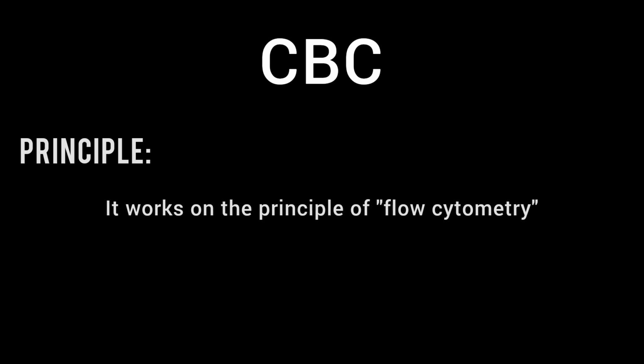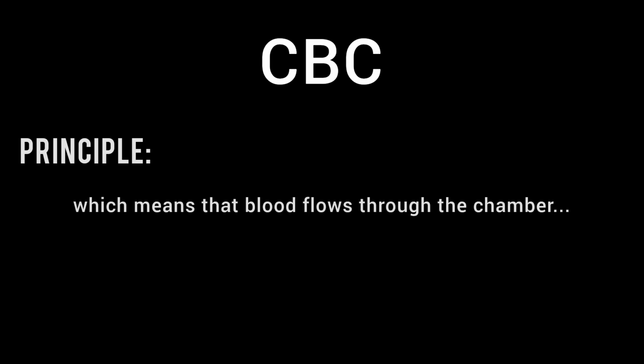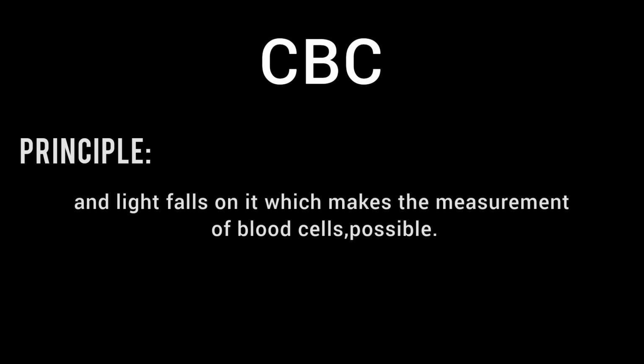Now let's talk about its principle. It works on the principle of flow cytometry, which means that blood flows through the chamber and light falls on it, which makes the measurement of blood cells possible.